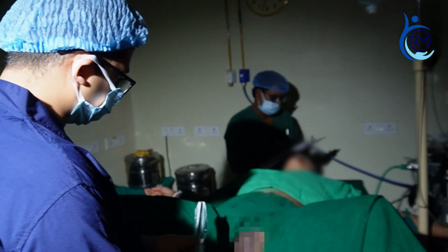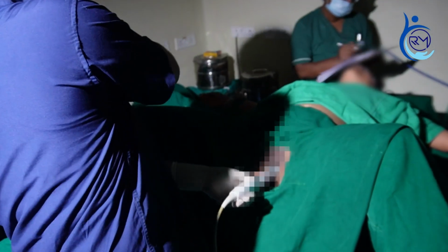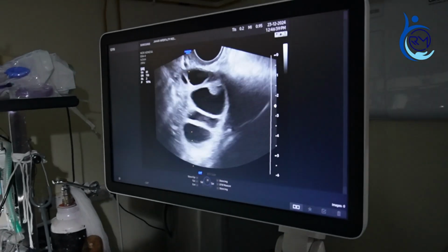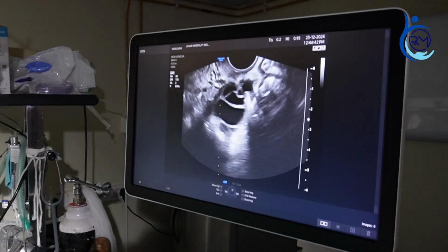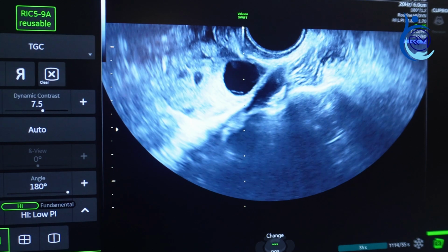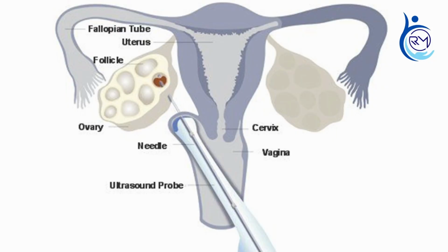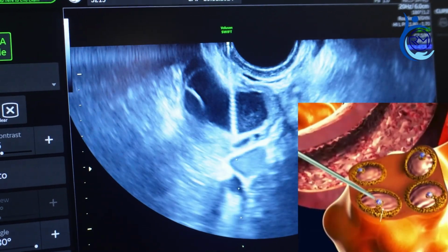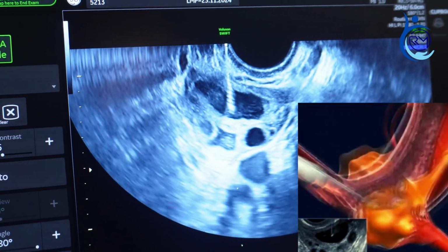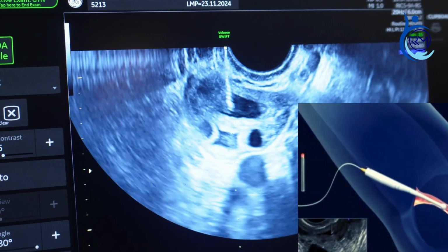During this procedure, an ultrasound guided operator inserts a 16 to 17 gauge outer diameter needle through the vaginal wall into the ovarian follicle, taking care not to injure any nearby organs or blood vessels. The outer end of the needle is attached to the suction device. The needle is passed through the posterior vaginal wall or fornix. There should be a minimum gap between the ultrasound probe and the ovarian cortex. Once the follicle is entered, suction is carefully applied to aspirate follicular fluid containing cellular material, including the oocytes, that is, your eggs.